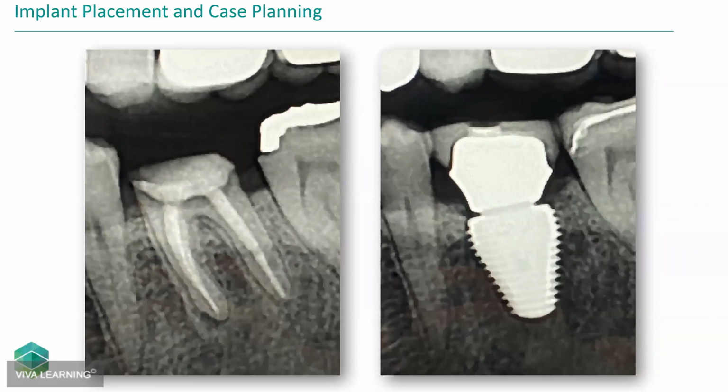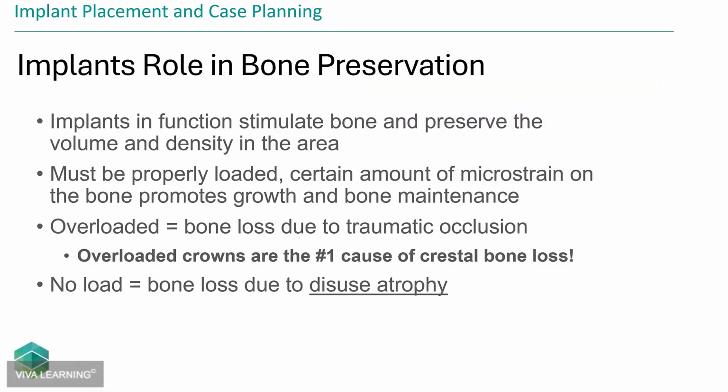So this is a standard case in my practice. This is a system that I have used for molar replacements. There are also other options, but this is just a classic example of taking a broken down root canal tooth and giving the person a great solution without prepping natural teeth that don't need it.